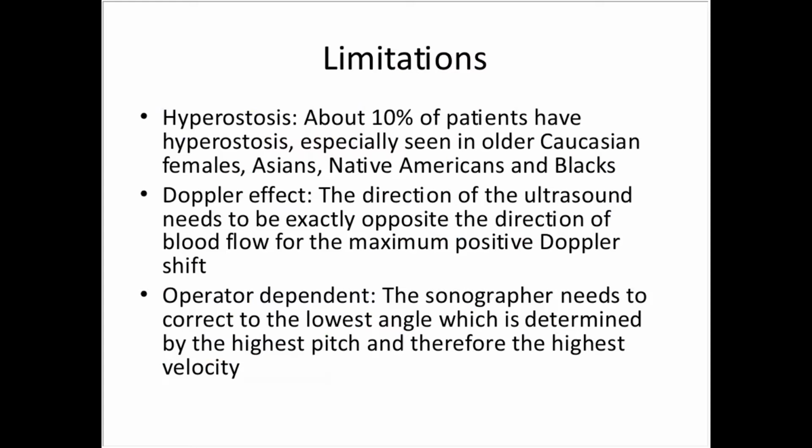With a little practice, though, the sonographer needs to correct to the lowest angle, which is determined by the highest pitch and therefore the highest velocity.